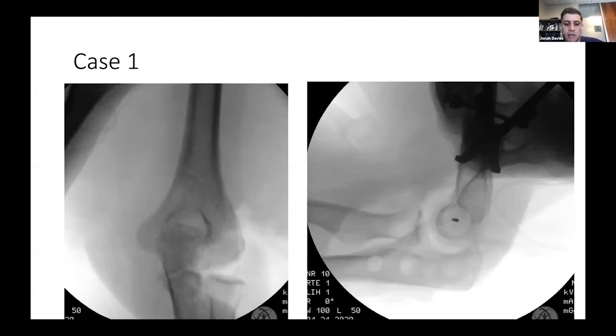Now, the problem is, in this case, I thought I would like to use an internal joint stabilizer, which is again a brand name, but a sort of an internal hinged fixator. And because of that, you have to put that pin in the isometric point. So you have to just think about how to do that. And I've gone to using suture anchors and laying that sort of around the pin, so that the pin can, very importantly, stay isometric. Because if you're going to be moving through the pin, you have to make sure that it's isometric, but that I can still get the ligaments to heal at the isometric point. So I can kind of show you here.